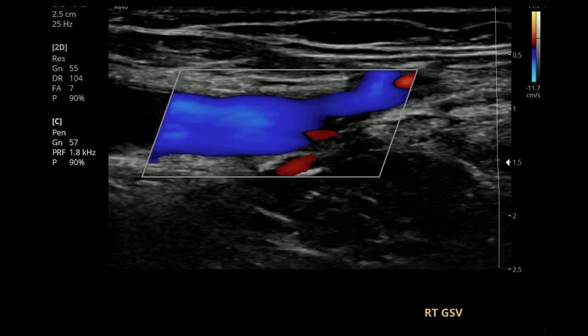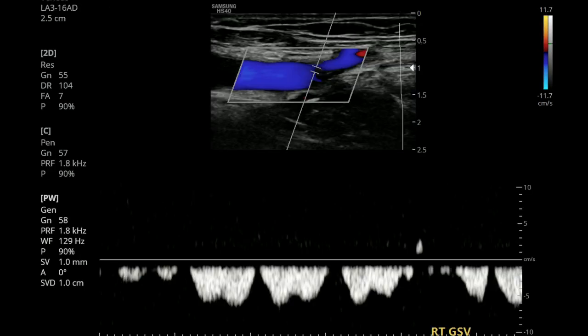This is what the color for the GSV looks like. You need to make sure that the angle and the angle of the vessel are going in the same direction. Also make sure the settings for the scale are set to an appropriate setting so you can get color filled in all the way. This is what the pulse wave is going to look like. For veins, you don't need an angle on pulse wave — just make sure the color box has the correct angle. For the GSV, you're not going to need to compress; just let the waveform go all the way to the end.